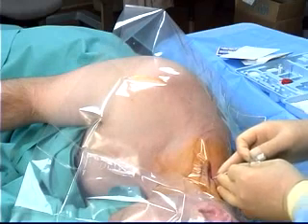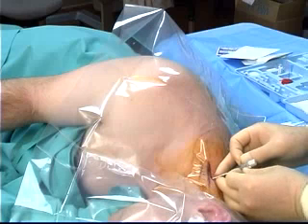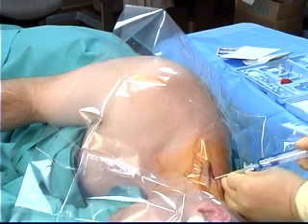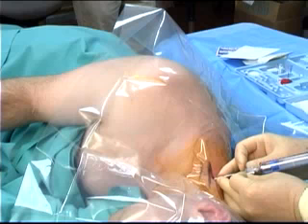The trapezius and levator scapulae muscles are again separated with the fingers of the left hand, and a 17 or 18 gauge insulated Tuohy needle, which is attached to a nerve stimulator set at a current output of 1 to 3 milliamps, a frequency of 2 Hz, and a pulse width of 200 to 300 microseconds, is advanced, aiming towards the suprasternal notch until contact with the bony structures is made. Notice that this needle always remains on the plane of the line drawn from the C6 dorsal spine to the suprasternal notch. After contact with the bone, the stylet of the needle is removed and a loss of resistance to air syringe is attached to the needle.